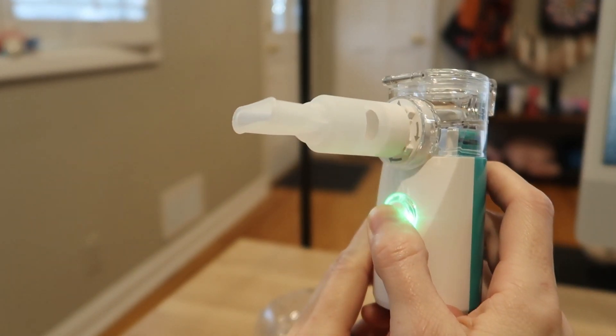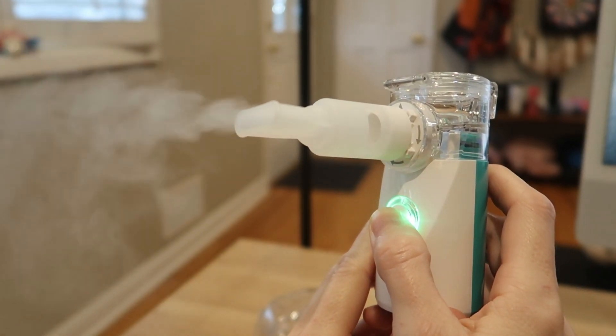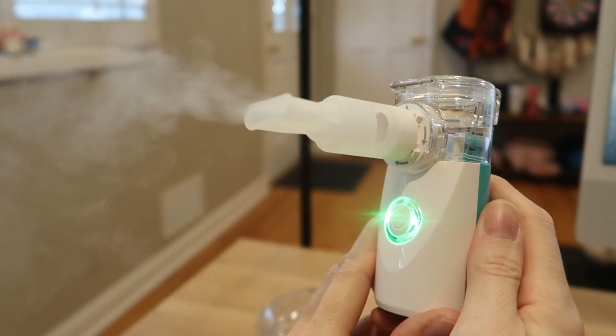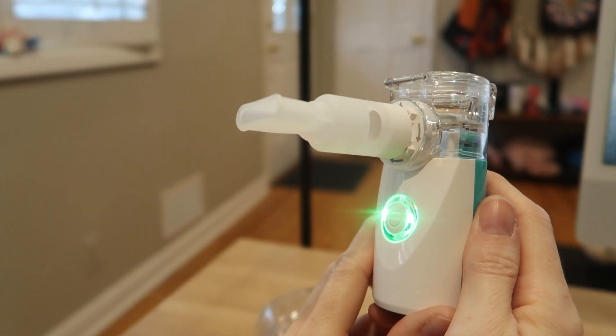To avoid clogging, simply activate the cleaning mode with a five-second long press. It'll automatically shut off after 20 minutes of continuous use, but you can turn it right back on if needed.